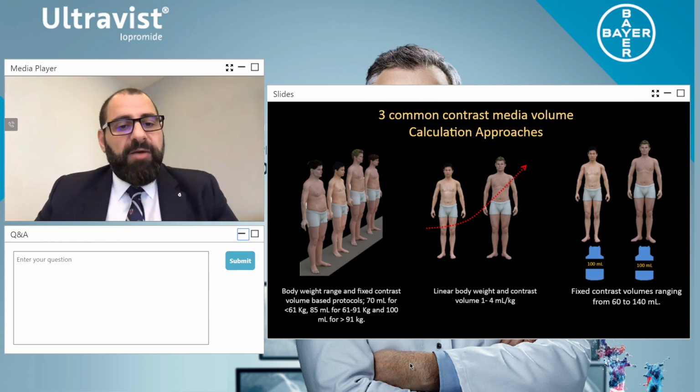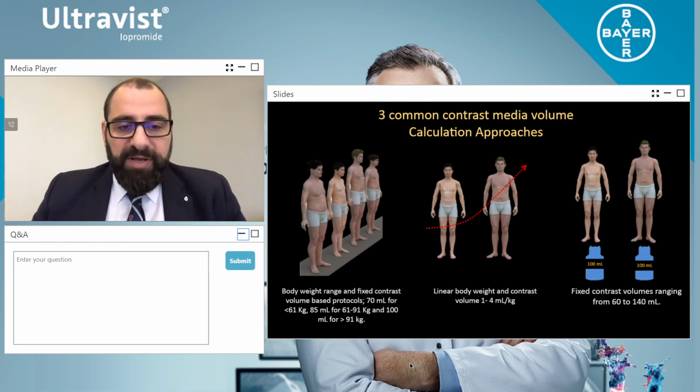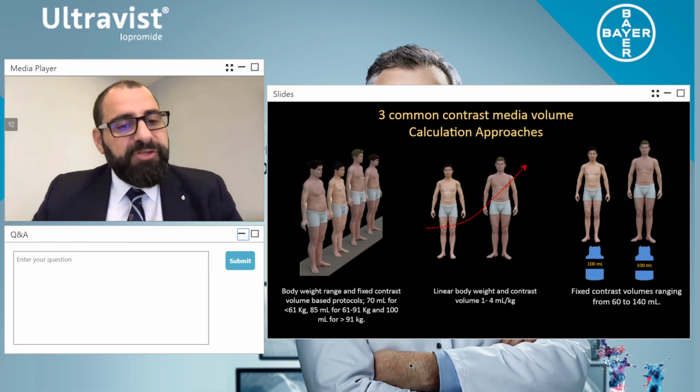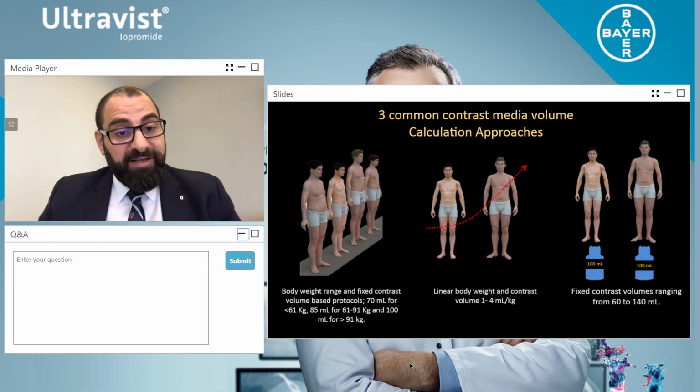So with these three common contrast media applications, people are using weight-based protocols. Look, it's really up to you what you do in your institution. But what I really like to say here is that it's not just about the contrast volume that people should worry about, because if you look at renal safety, there is no evidence, according to the American College of Radiology and the European Society of Urogenital Radiology, that contrast media actually causes contrast-induced nephrotoxicity. It's a risk factor, definitely.